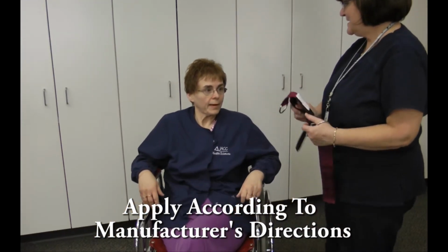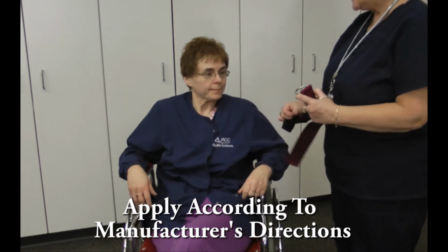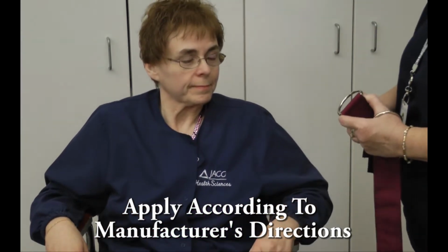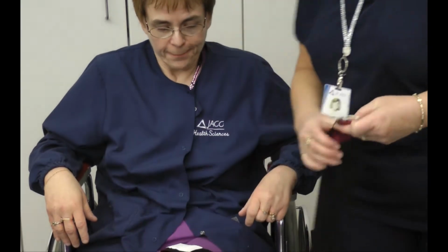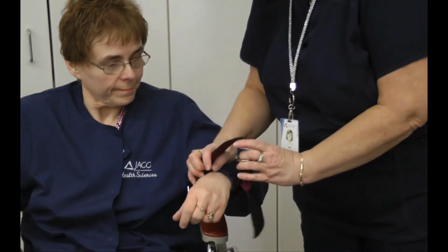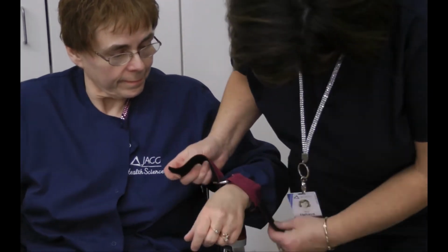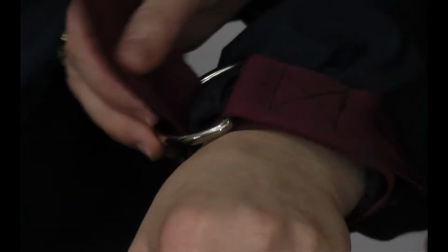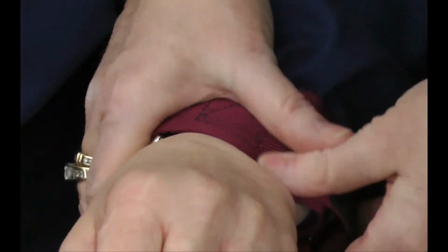Hi, Melissa. Hello. How are you? Good. These are wrist restraints. Now, we're just putting them on for pretend, but I do want to demonstrate how these work, okay? Alrighty. So, the very first thing is you're going to want to hold them out. The wrist goes through here, okay? You're going to want to take, and then move your arm back just a little bit, see if you can get it around here. We're going to put the Velcro on.